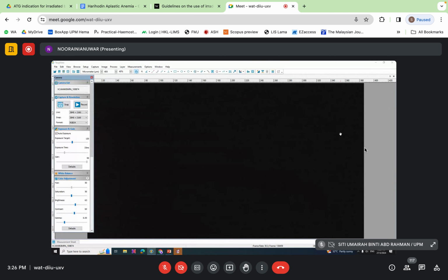So I think the take-home message for today is that if you want to determine HLH, the key feature is actually looking at the bone marrow, whether it's aspirate or trephine. When you come to aspirate and trephine, aspirate may have limitations because if the cells get trapped in the bone marrow, they don't come out. You cannot find those cells, and then you cannot say it's not hemophagocytosis. So luckily I got trephine. Trephine will show them, right?